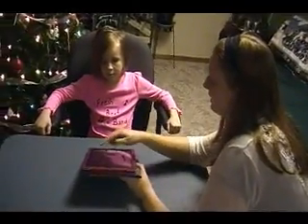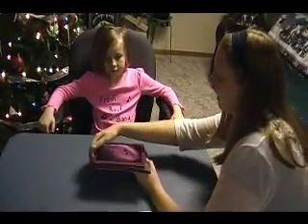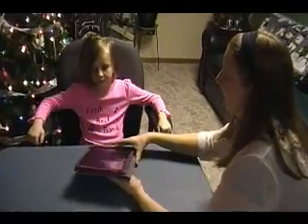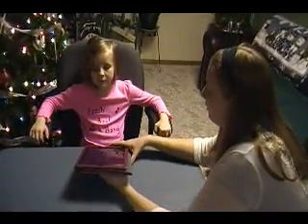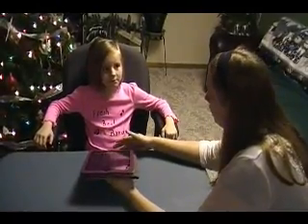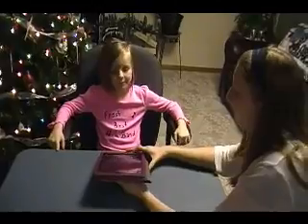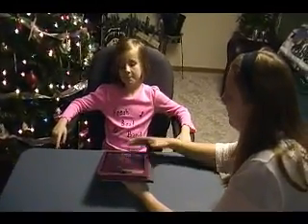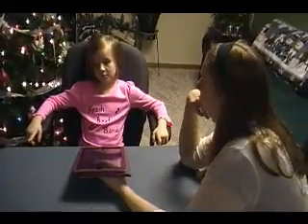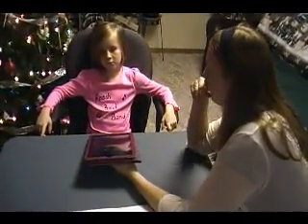So there's going to be different things in here. For example, this one says eat. If you press that, it says eat. Over here, I'm going to turn the volume down a little bit because that's kind of loud. So, for example, if you were getting hungry and you wanted to tell your mom or dad that you wanted to eat, you just go ahead and you press that. Good job. Alright, and then there's these other signs on here. There's some like doctor or medicine. Maybe you need some of your medicine your parents forgot, or go to the doctor because you're not feeling good.